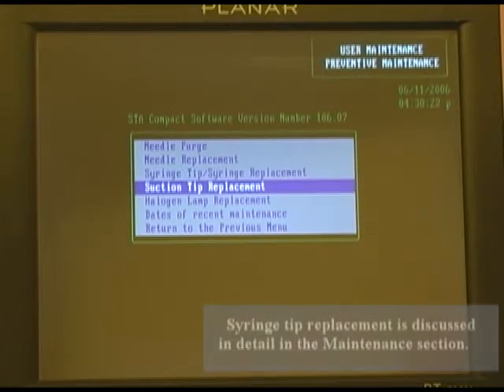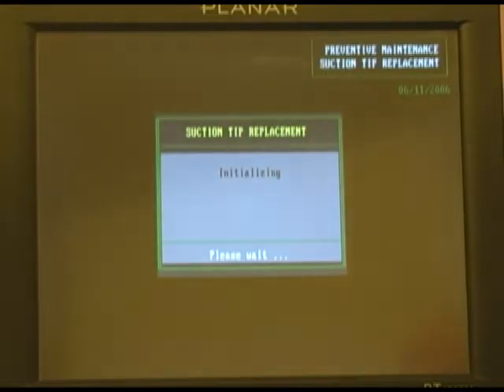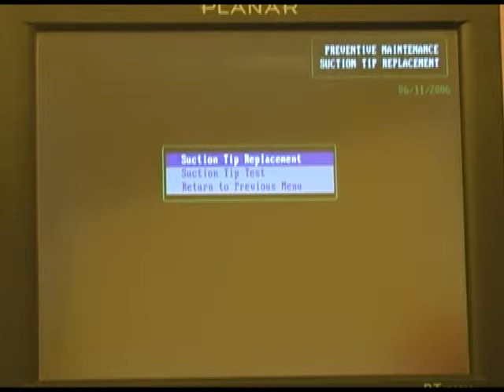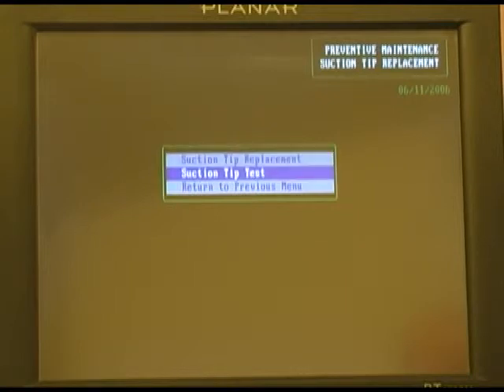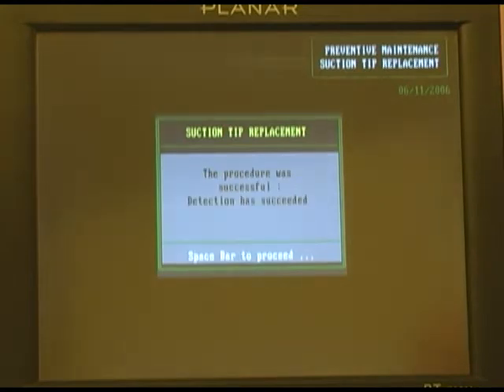Moving on, we're going to talk about suction tip replacement. Let's highlight that. Before replacing the suction tip, or gripper as it's often referred to, do a suction test first to see if the instrument is performing correctly. If the instrument completes this test successfully, it may not require a suction tip. You may just want to remove it, clean it, return it, and then test it again.